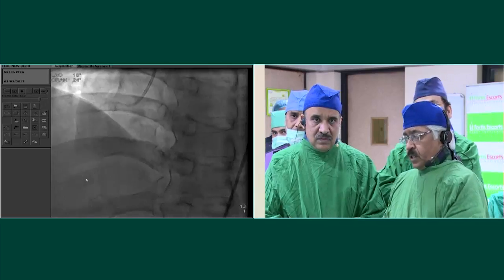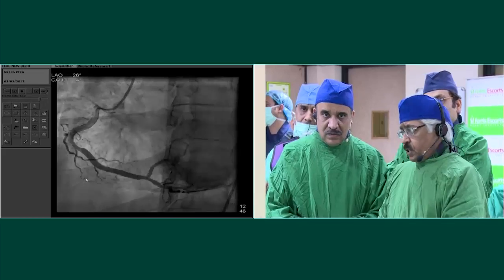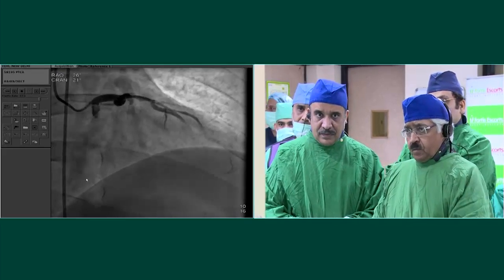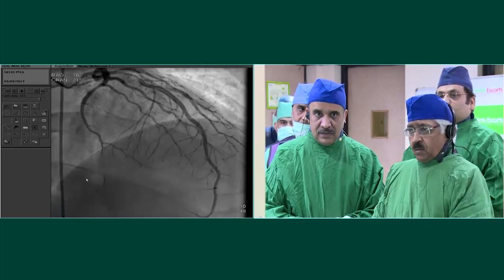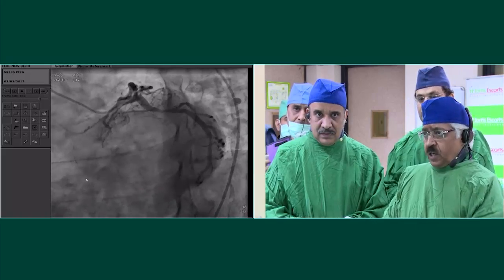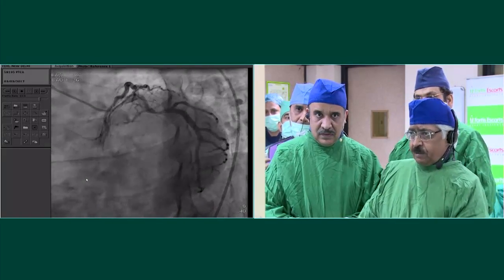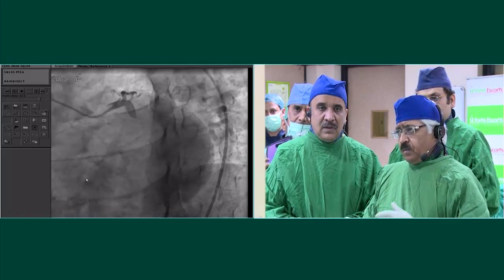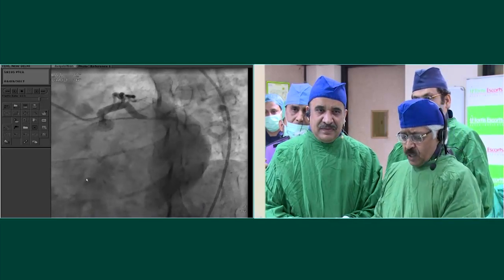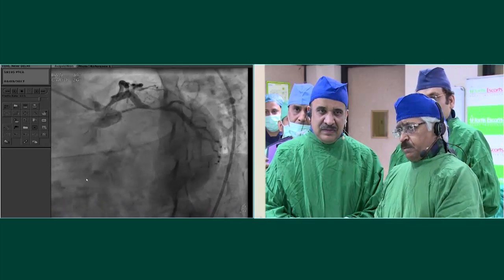No, there are no other comorbidities. Yeah, so that's the reason we got to decide the therapy, and that's he could absorb the scaffold. Very good. Absolutely. That's why it's a very good indication, because we have to treat him for the rest of his life, and we don't want to implant any metallic stents if possible.